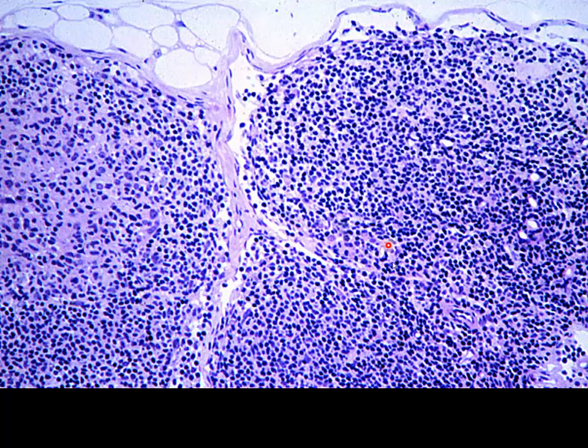Here we see a huge collection of lymphocytes, possibly a germinal center of a secondary lymph nodule. It's hard to tell at this particular magnification, but I'm assuming as we back up, we're going to see this as a lighter germinal center.